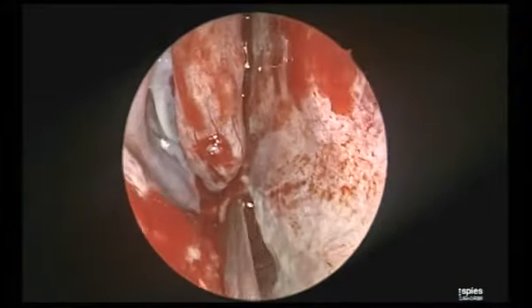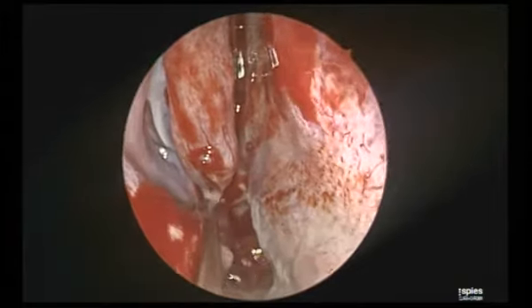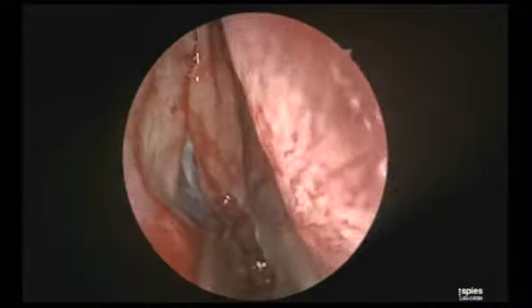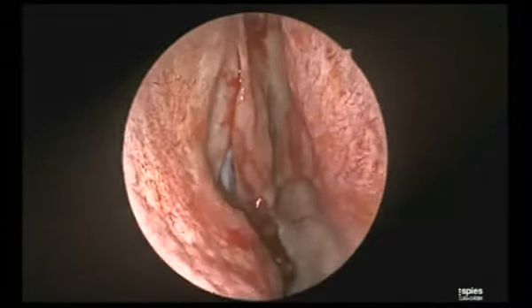There are many ways to deal with these turbinates, inferior and middle, and in the number of cases ahead, we'll show something different in different cases. Satish, I am officially asking you an unofficial question, on record for off record.